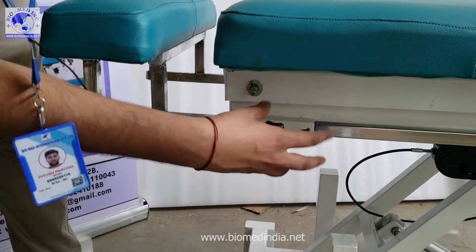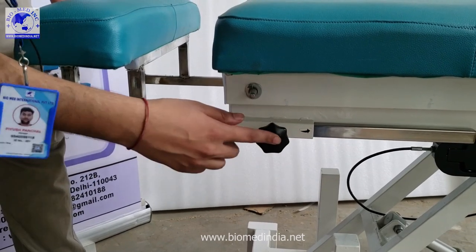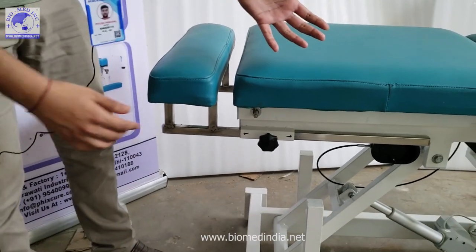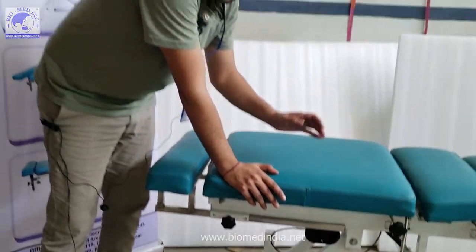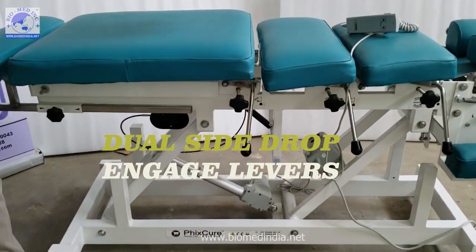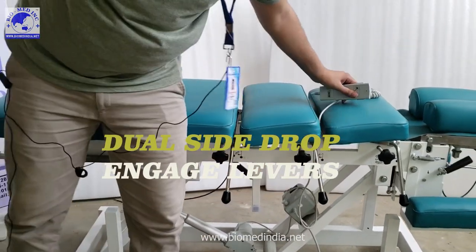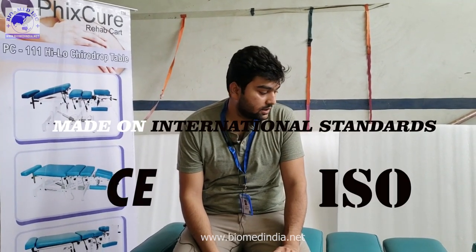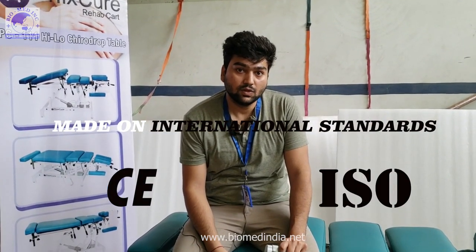The drops are adjustable and can be engaged from both sides using levers on each side. We are using very high-quality CNC-machined pipes and top-grade materials. This table has been built to international standards.